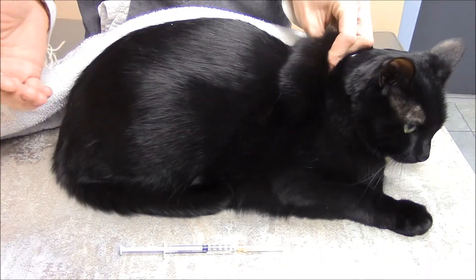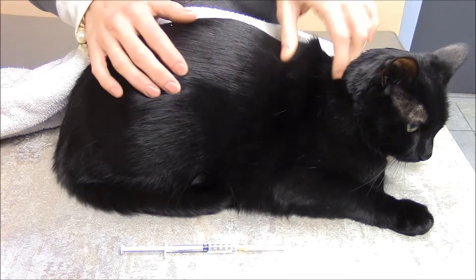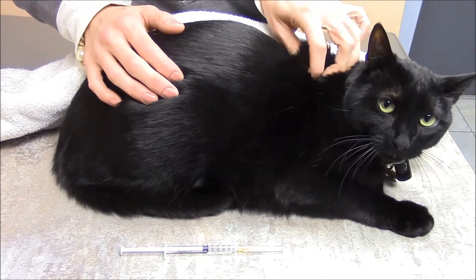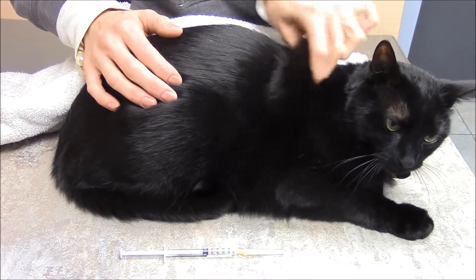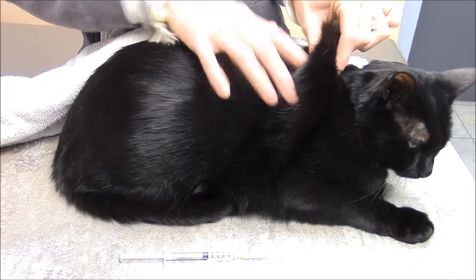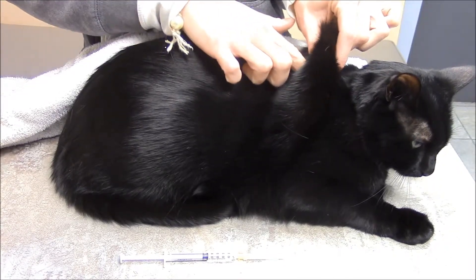To give a subcutaneous injection, you're going to tent the skin. I'm going to take my pointer finger, my middle finger, and my thumb and kind of create a triangle, if you will, and then pull up on the skin, and then you can actually feel the tent.